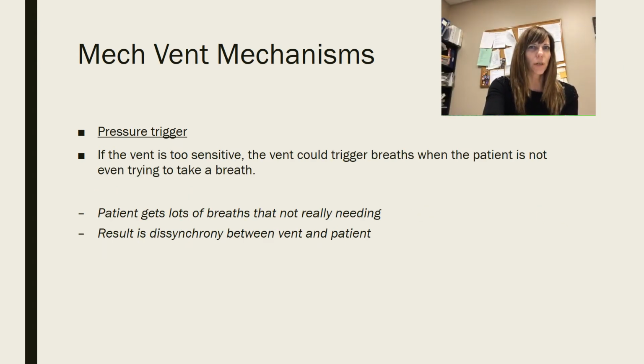Okay, this one's kind of tricky. Basically, if a ventilator is too sensitive, then a patient could get a breath that they didn't even ask for. Like I said previously, the patient should have to suck in -2 centimeters of water pressure for the vent to start a breath. But if that trigger sensitivity is set too sensitive, the patient's heartbeat could even set off a breath. Just the change in the thoracic cavity could start a breath. I've seen patients who were right out of heart surgery and the vent was set too sensitive and the patient was getting 60 breaths a minute because that's how fast the heart was beating. So you have to watch the sensitivity.